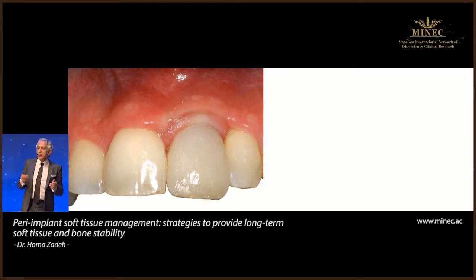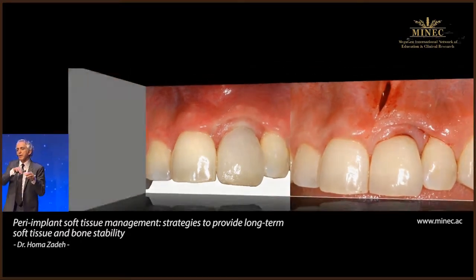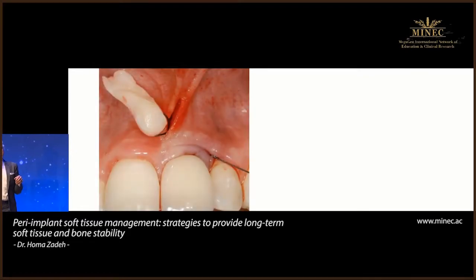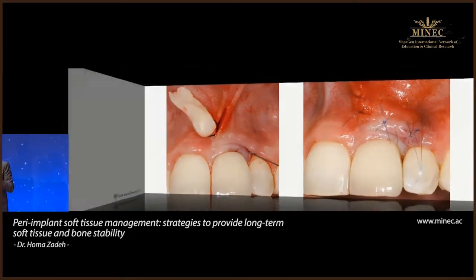So the way we can improve that is to try to use Vista, vestibular incision, subperiosteal tunnel. What I'm doing now is bringing this tuberosity connective tissue graft underneath the surface, bulking it up from underneath, and then once this is brought down, we can coronally advance the gingival margin where the cleft is to try to cover the area of the cleft and get root coverage in that area.